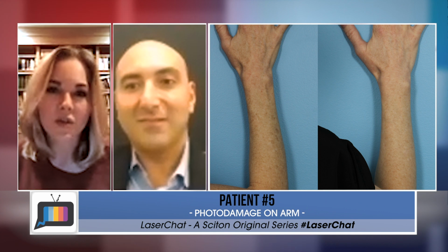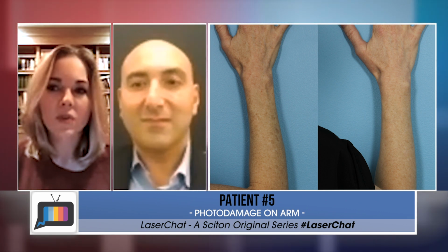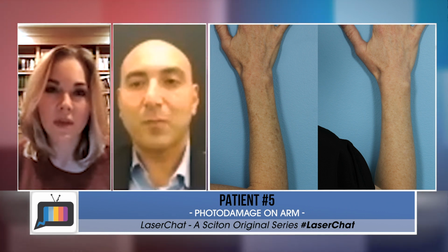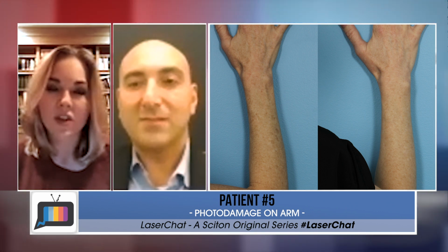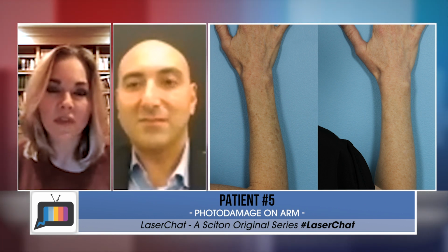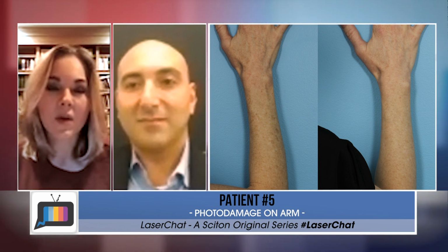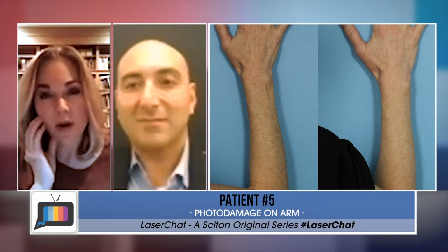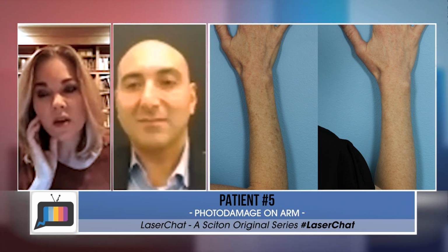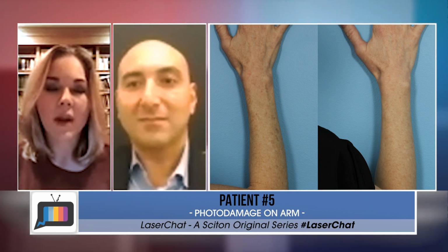So a textural change. So again, I often like to treat these patients now, thankfully with the Hero, because as you say, that gliding BBL is just a beautiful thing. It's just not as uncomfortable. I think it delivers a better result and a more even result. And it's arguably not that much quicker than the stamping because you're putting in a lot of energy and we're doing different wavelengths. But I think the results are so much better.